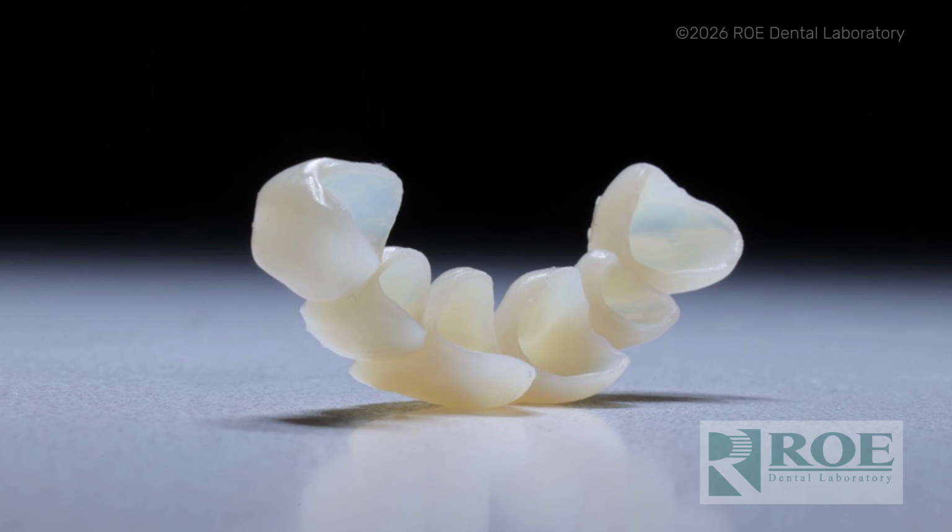Now, it won't come out like this. This is what we see in photos, like, oh, it looks awesome, but this isn't how it comes out. You're going to have supports. I always recommend get in the habit of never breaking off the supports till after you cure. I know they're zipper easy to remove, and the newer supports that are coming out are literally like a zipper, maybe we'll get there. But I'm going to tell you right now, if you break enough of these, you won't do it.